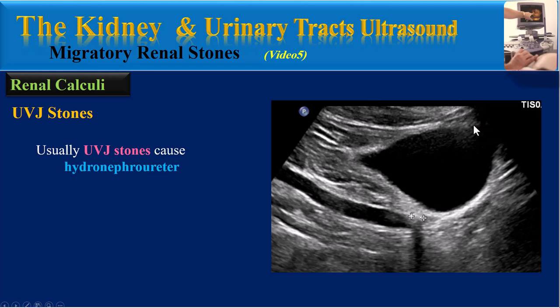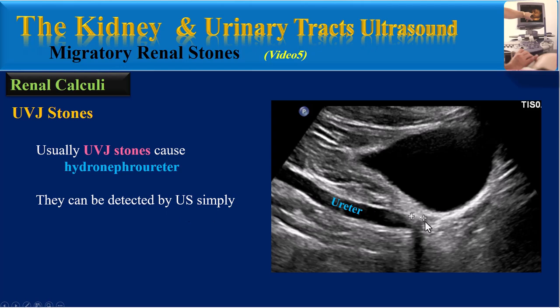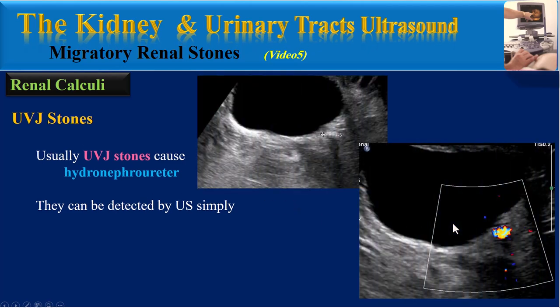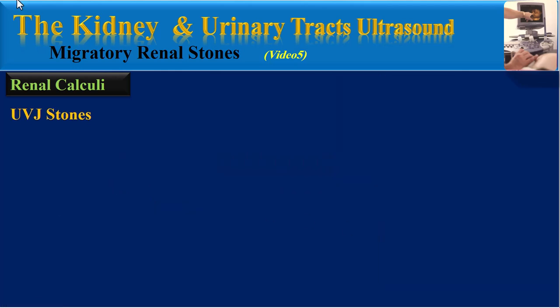Usually UVJ stones cause hydronephroureter. As you can see in this transverse abdominal ultrasound image from the bladder, here is the distal hydroureter, and the stones can be detected by ultrasound. We can see a stone with obvious acoustic shadowing. Also, if we use color Doppler ultrasound, we can find twinkling artifacts.